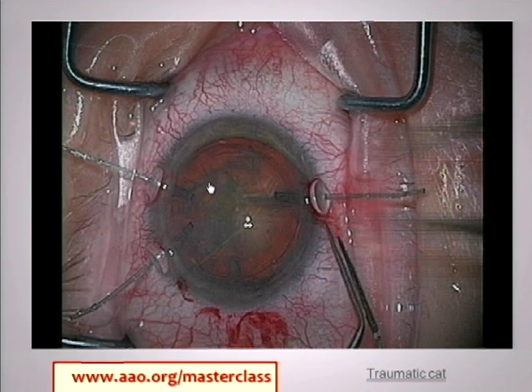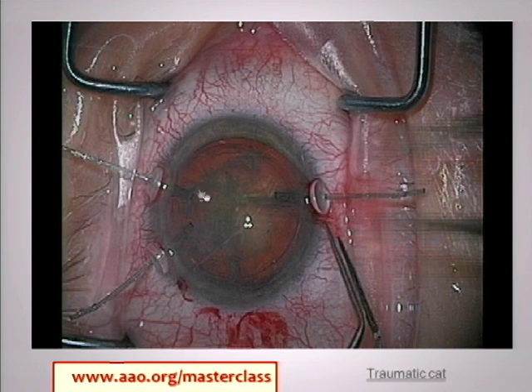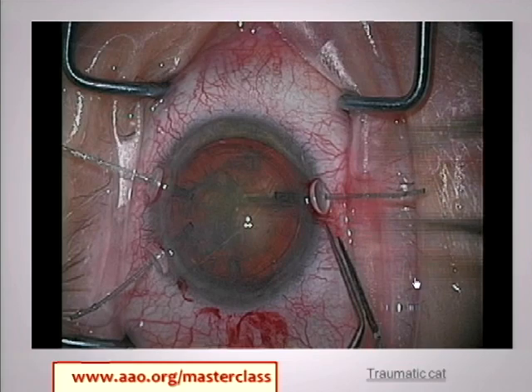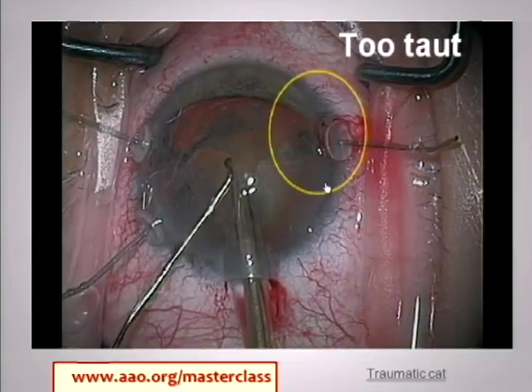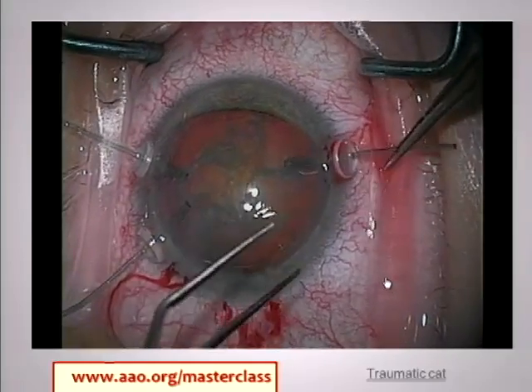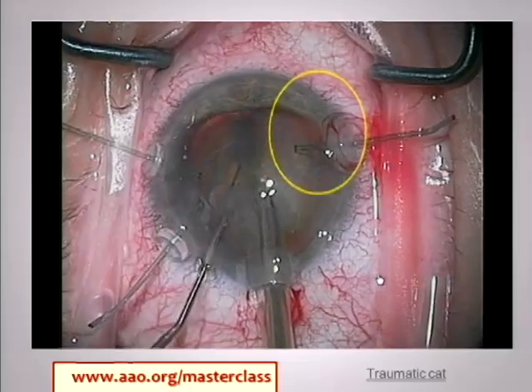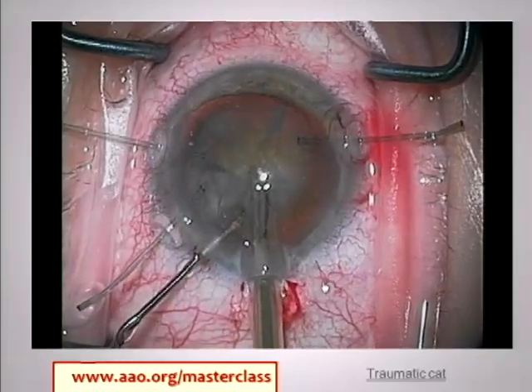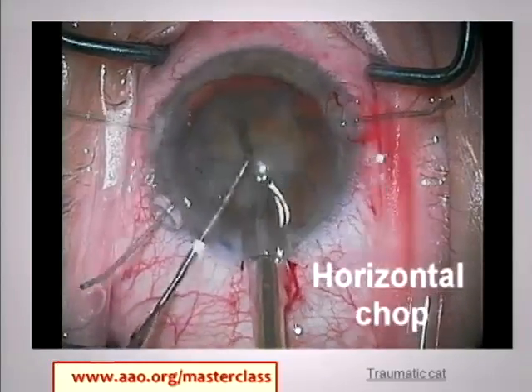The number one mistake I learned the hard way is you tend to make these a little too tight, thinking about pupil retractors and needing to put some tension on it. The time to look is when you go in with the phaco tip, because you don't know how far back the lens will fall backward. I watch where the capsule retractor is, and if I see it tent up too much, I stop. I can see that I'm tenting the capsulorexis too much — it's the hydrostatic force of irrigation pushing the lens back, suddenly tensing up the anterior capsule. So I've loosened that, and now when I go in, I make sure I'm not overly peaking my capsulorexis before proceeding.